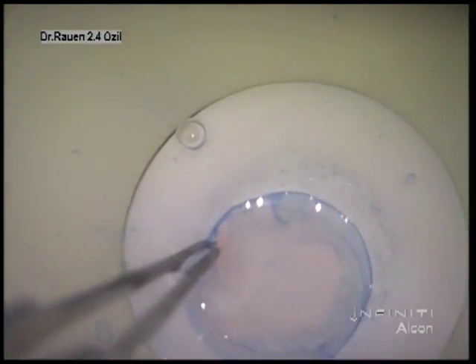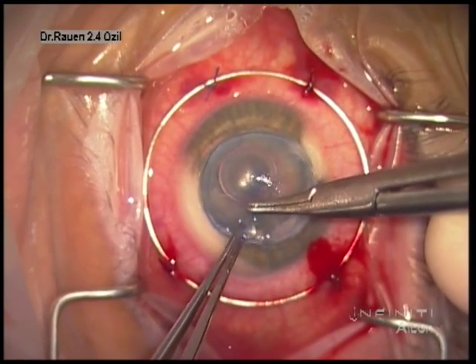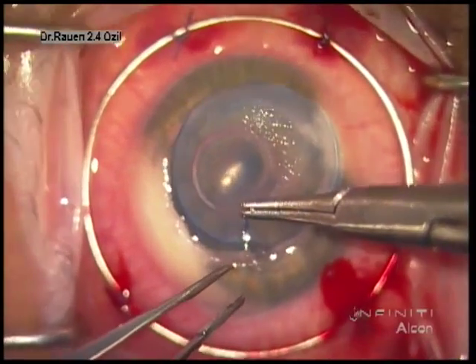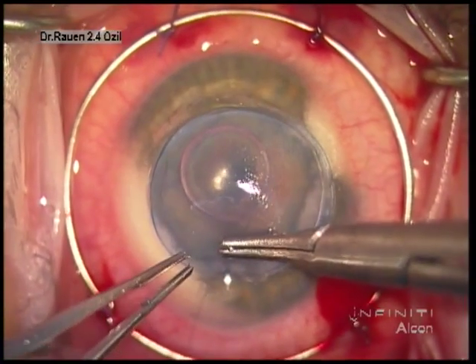We rinse the surface of Descemet's membrane of any viscoelastic. I do like to use Trypan Blue to facilitate removal of Descemet's membrane from the donor tissue, so that we know Descemet's has been removed.